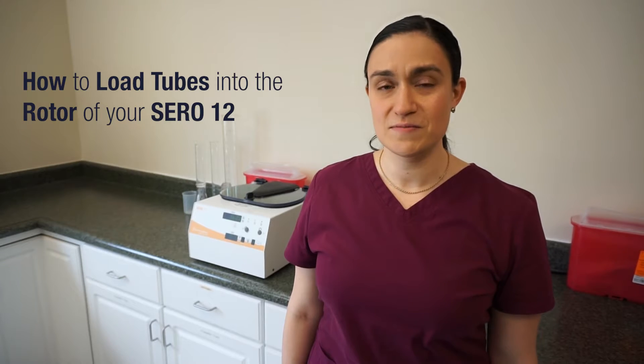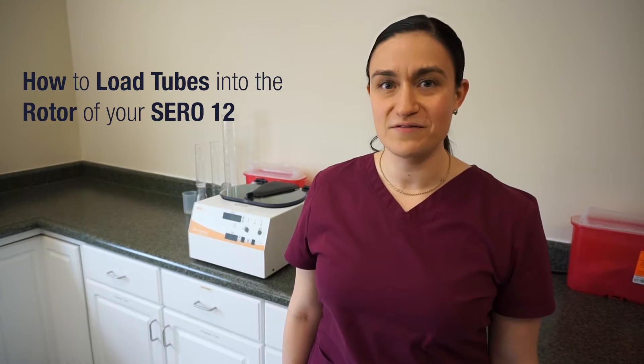Hi, I'm Dawn with Drucker Diagnostics, and today we're going to talk about how to load tubes into the rotor of your SERO 12 blood banking centrifuge. In particular, we're going to talk about how to make sure you always spin a balanced tube load.